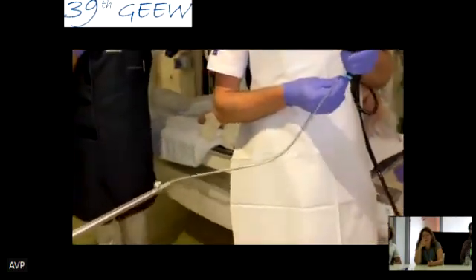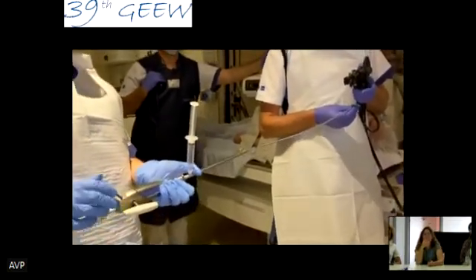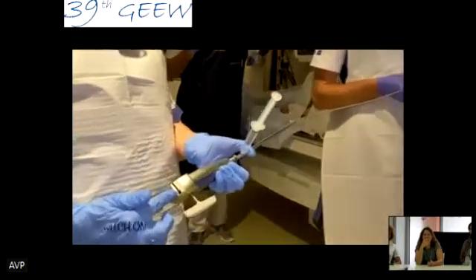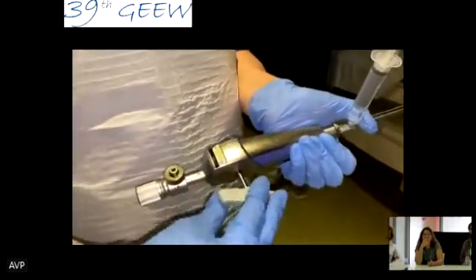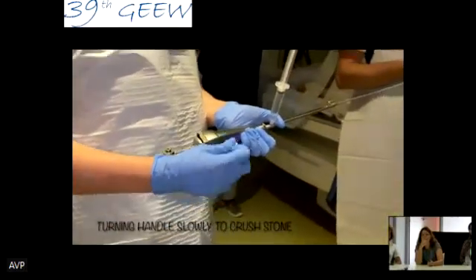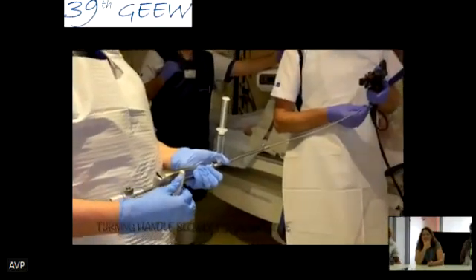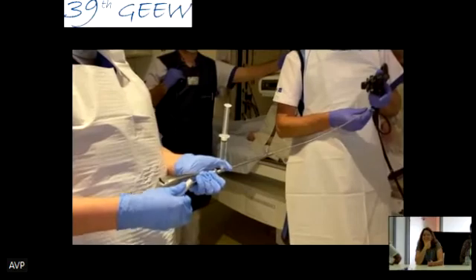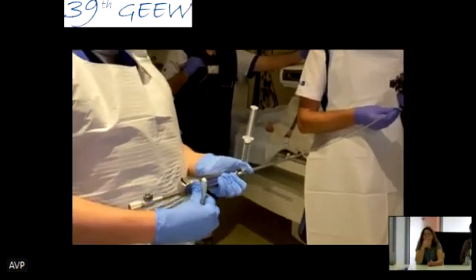You lock it there. And you put it on. And then we crush. I might end up learning this finally by seeing the video 3 times. It's very difficult. And you have your port to inject saline if necessary.